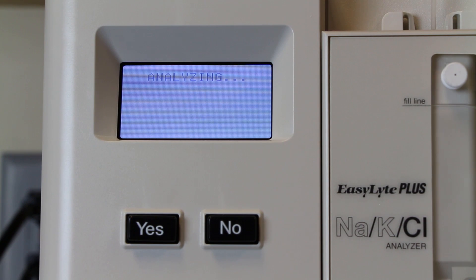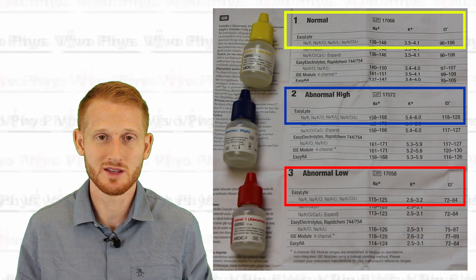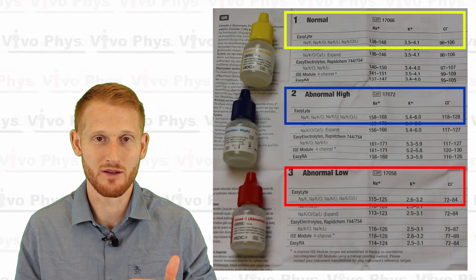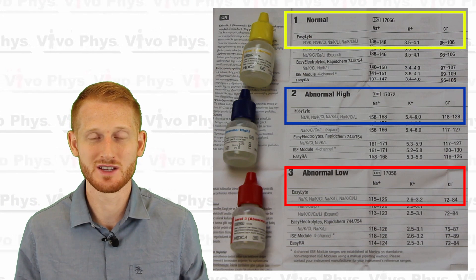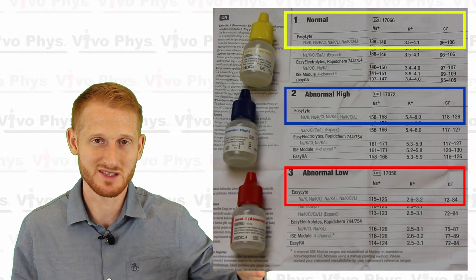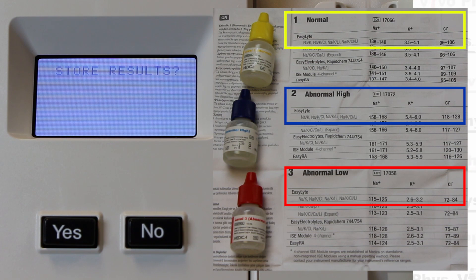After that, it's just a matter of waiting and hoping the machine spits out numbers that are within the quality control range. Open up the piece of paper inside the quality control packaging and look for the appropriate analyzer type — this is the sodium, potassium, and chloride analyzer. Look within the appropriate type of quality control (normal, abnormal high, or abnormal low) and check that the sodium, potassium, and chloride readings from the machine are within the acceptable range. If they are, hit yes, hit yes again to store the result, and then go back and do this again for the next quality control.